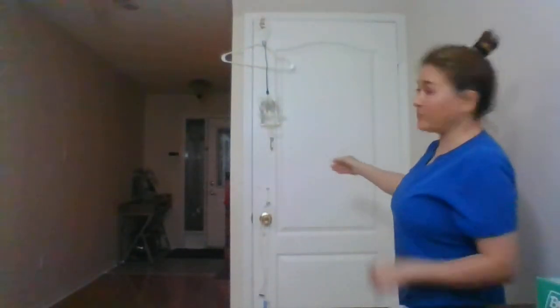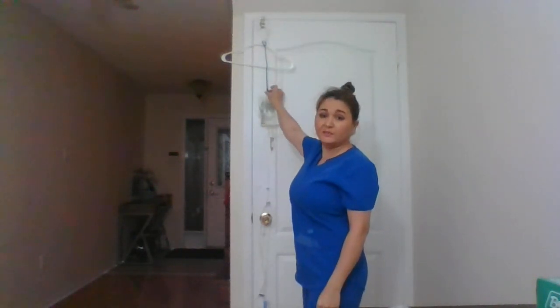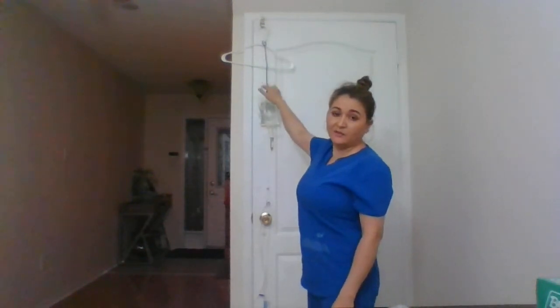As you can see, I have already set up my primary line over here, and I've already placed the hook to make sure that my mini IV will be higher than the primary IV. And that is all set. I will sanitize my hand.